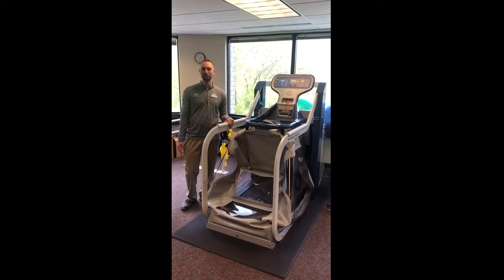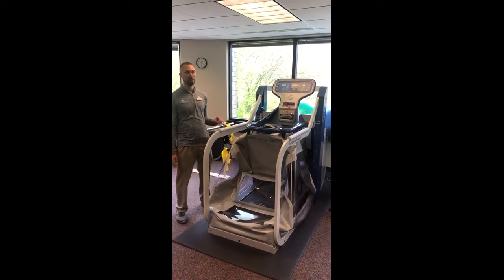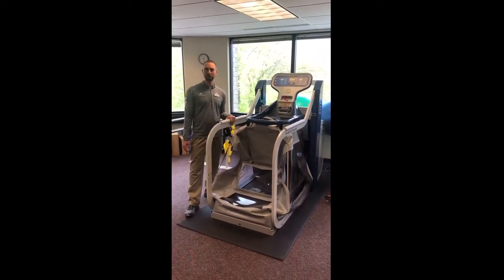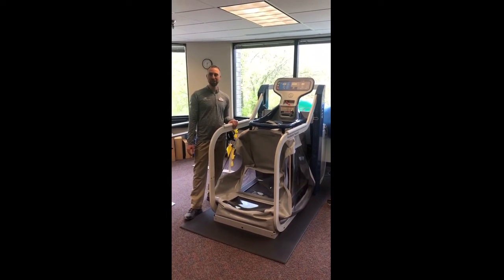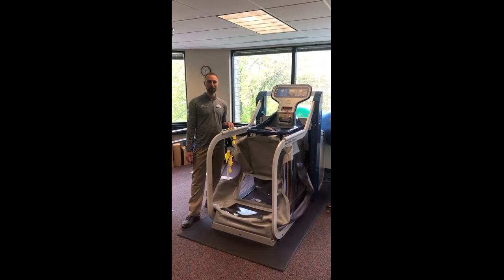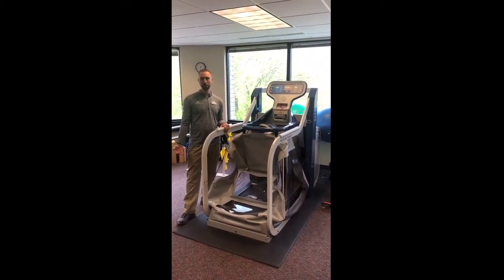Welcome to MedStar Health Mondays on VASCUM TV. Today we're going to talk a little bit about the Alter-G, which is our anti-gravity treadmill. We have an anti-gravity treadmill at the majority of our outpatient physical therapy sites. We use it for a variety of things, but it is especially good for increasing a patient's ability to get back to running, especially a sport such as soccer.